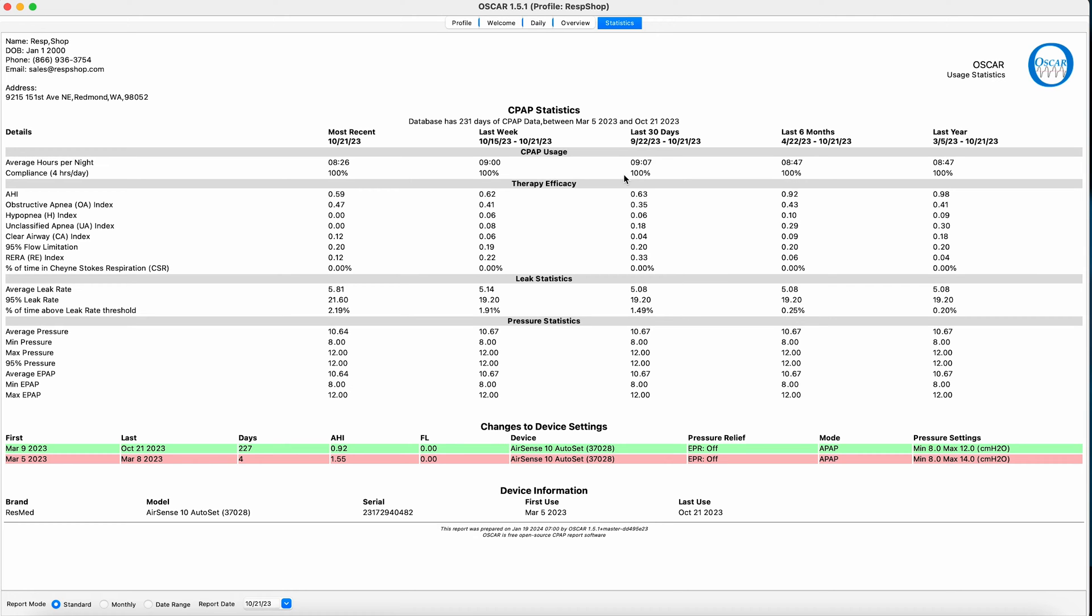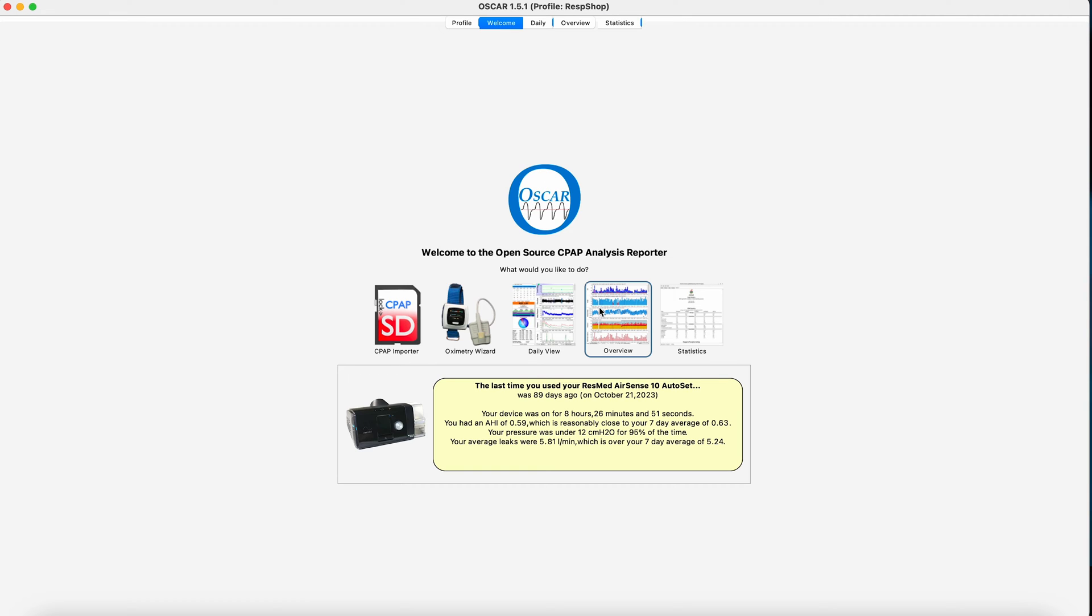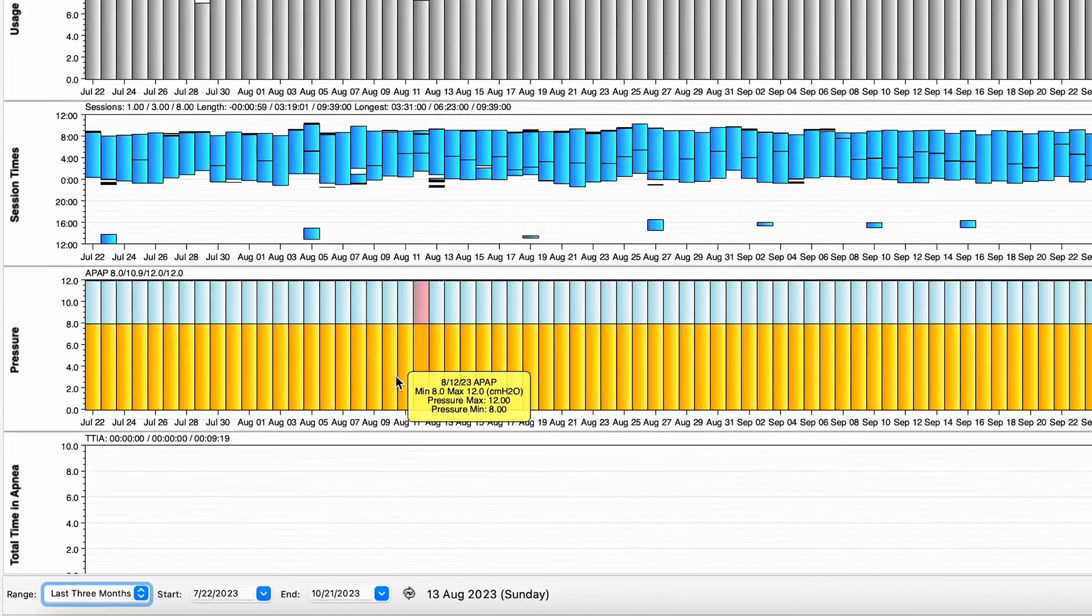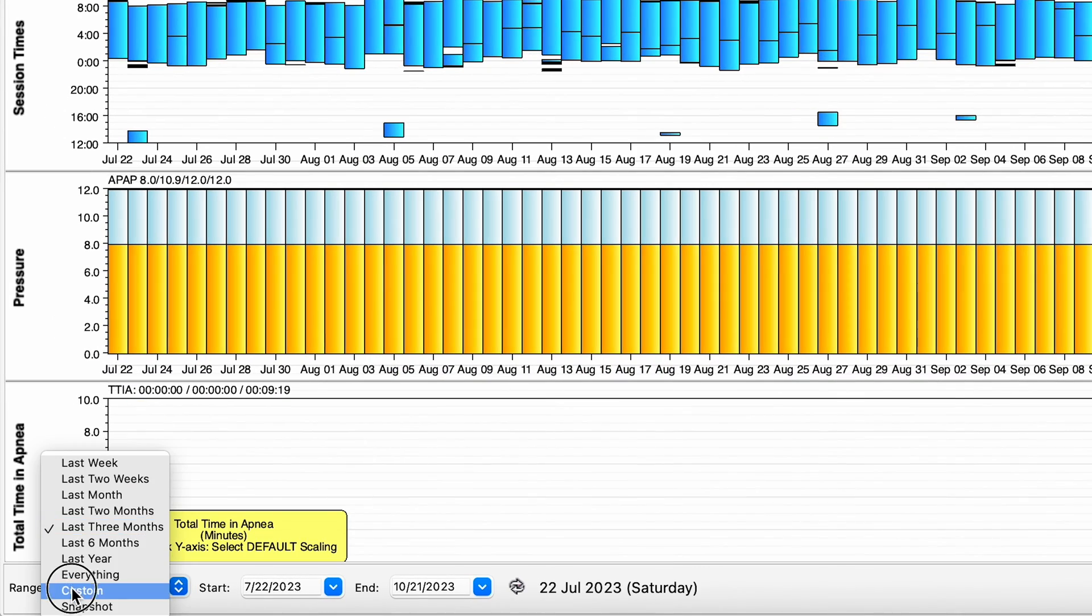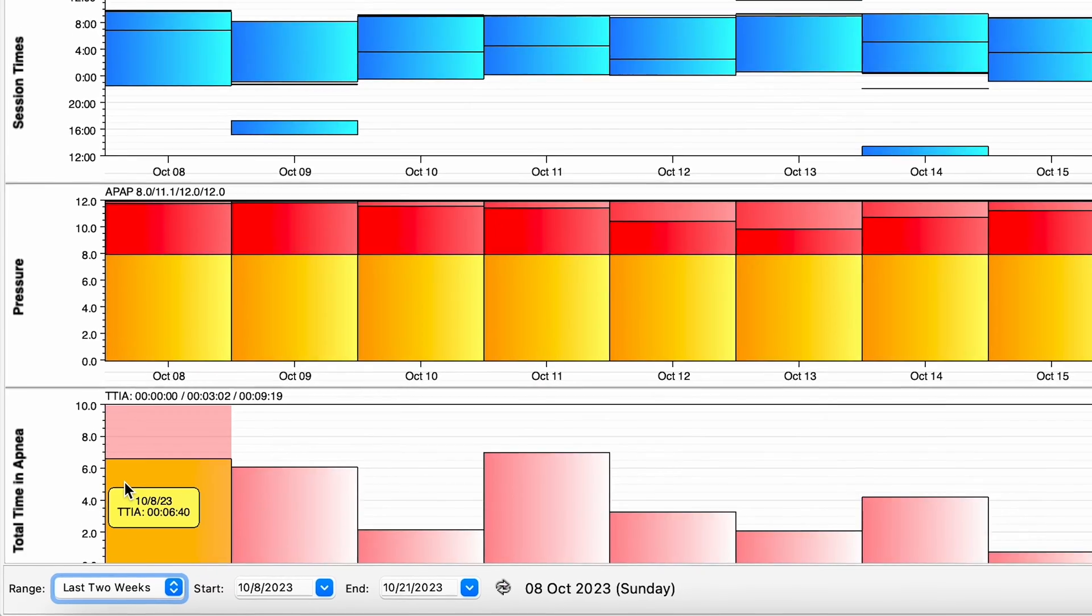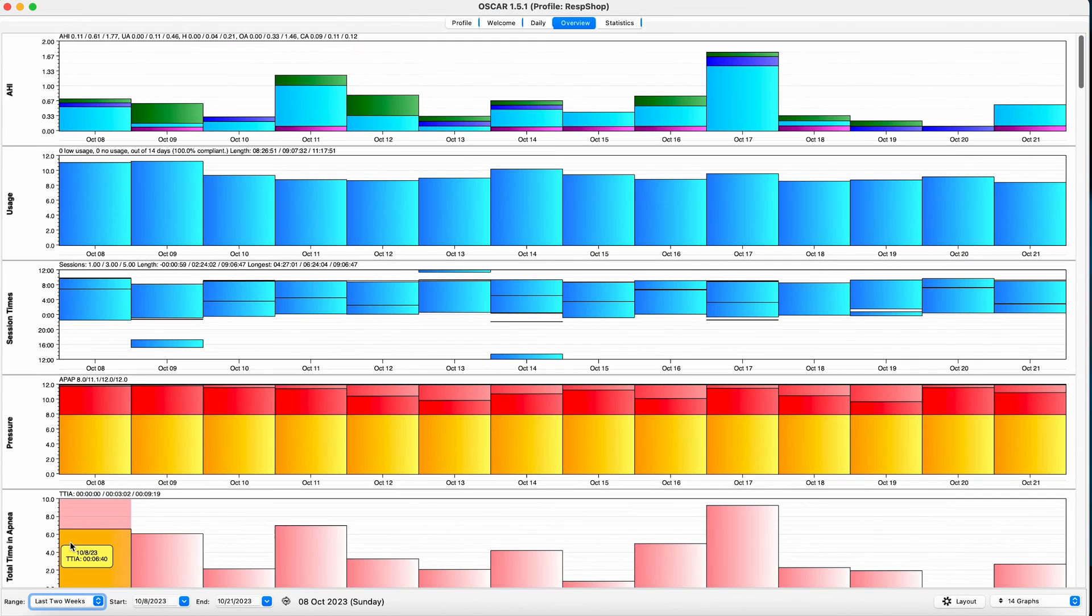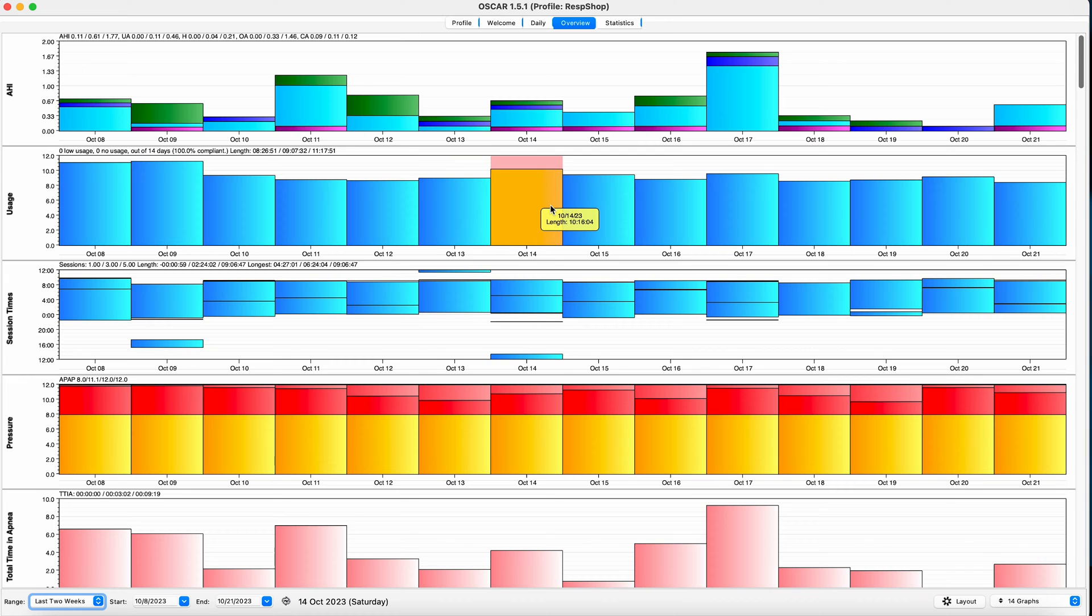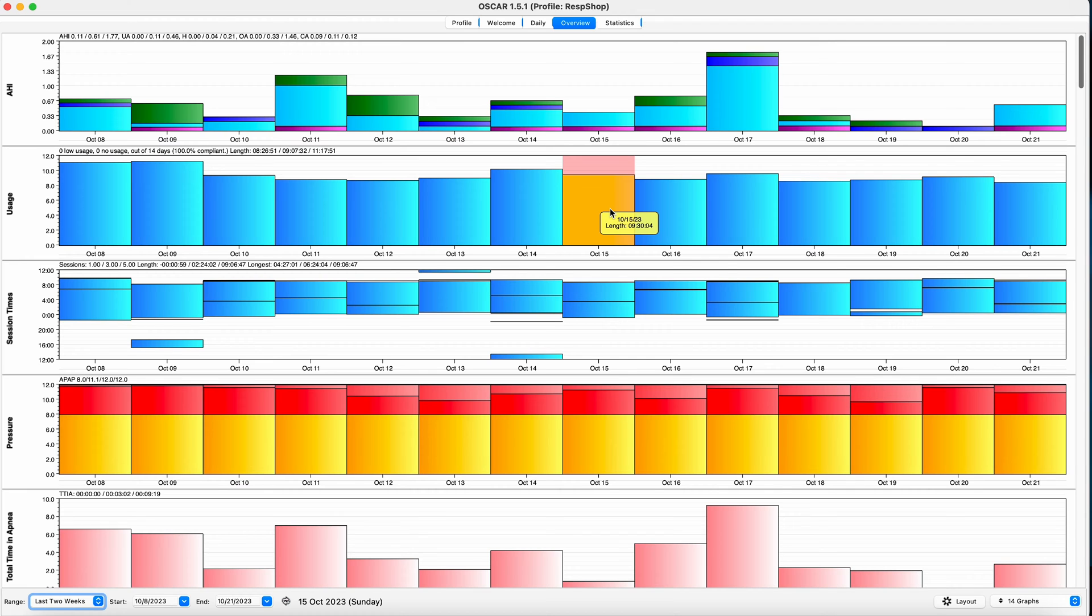The next icon, one to the left of statistics, takes you to the overview window. This window presents data for each night in the form of bars. Some of those bars indicate the levels of that day, for example, the pressure or CPAP usage, and some show the start, stop, and duration of something, such as your session times. The overview window can be used to provide a day-by-day snapshot of your data, rather than looking at specific periods in the statistics window.